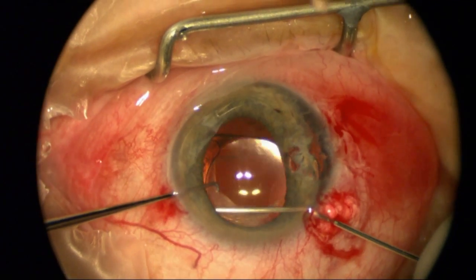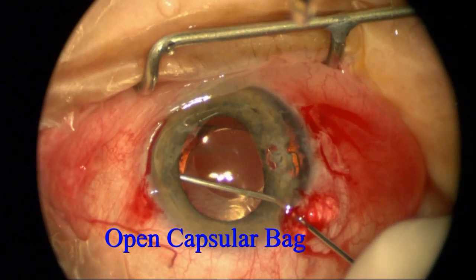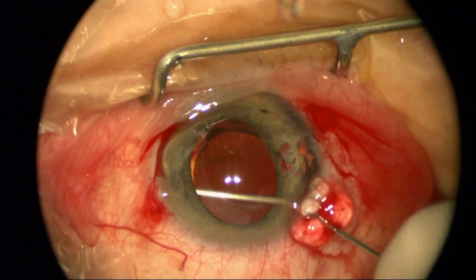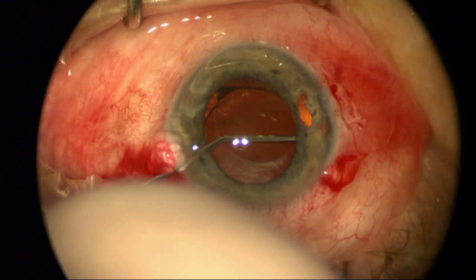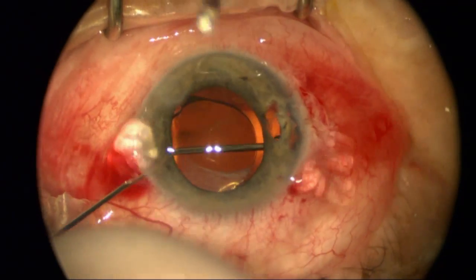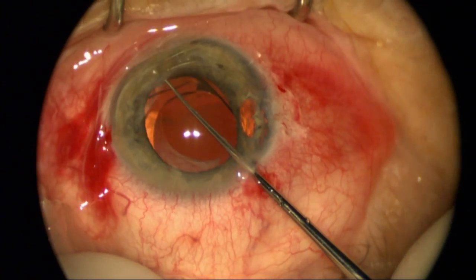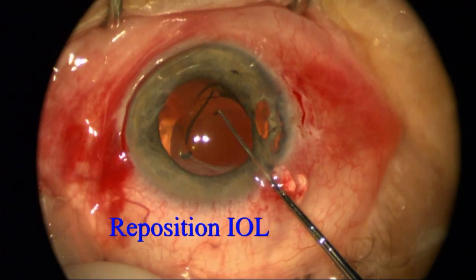I'm going to use a cohesive viscoelastic to open up the capsular bag. You can see the optic in one loop is in the bag with the other loop in the sulcus. I'm prepared to exchange the lens, but if I'm successfully able to open the bag completely, and it's a good lens with the proper power like it is here, I'm just going to go ahead and put this single-piece lens within the capsular bag.